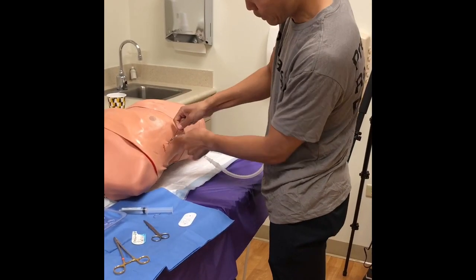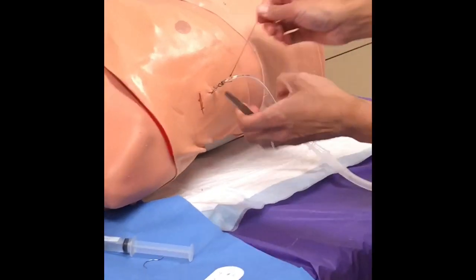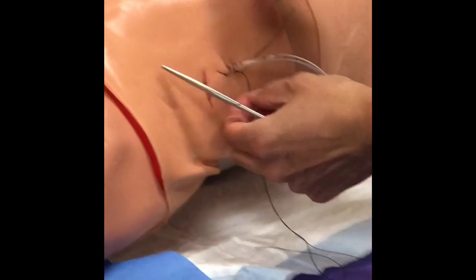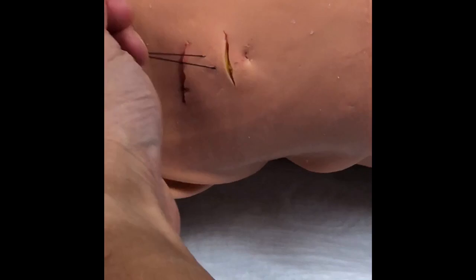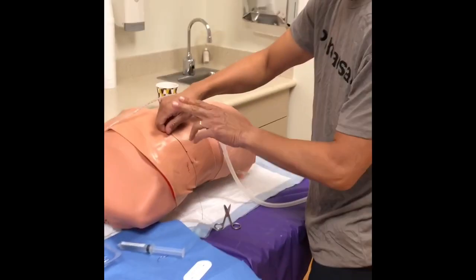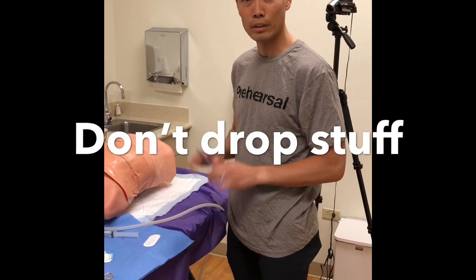Two to three days later, once the patient is better and the surgeon is ready to remove the tube, they undo and unwrap the suture. What you're left with are the edges of the purse string intact. Have the patient take a deep breath in, hold it, pull the tube out, and the skin closes. Tie it down right there — voila. You can then suture the skin closed, preventing reintroduction of an air leak. That's why I do it this way.